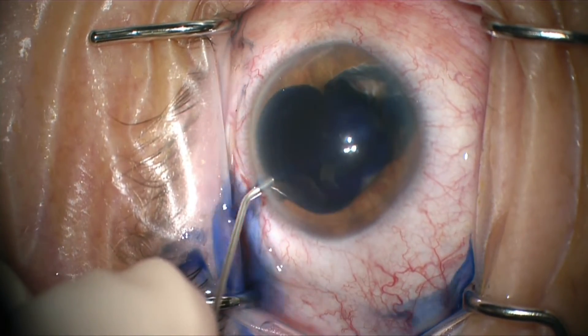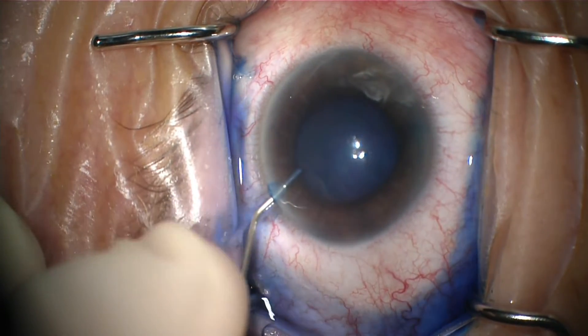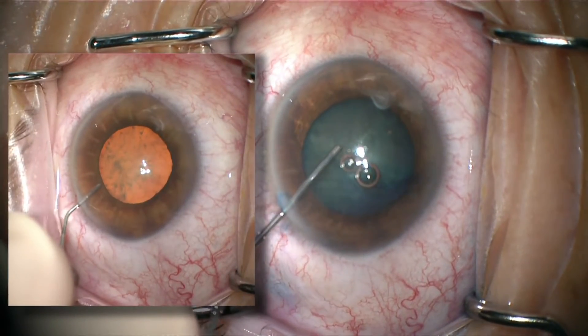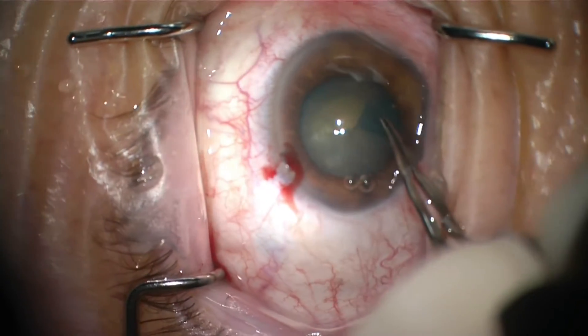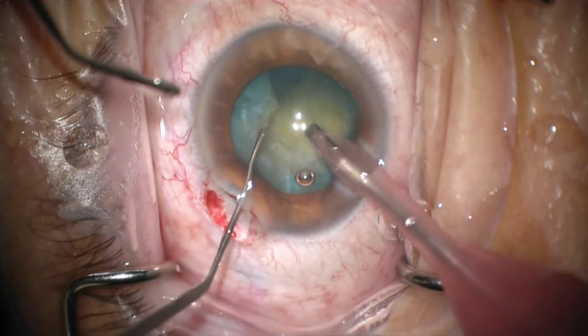We were able to handle it, but I think by trying to make our life easier, we ended up making it harder. You can see the red reflex wasn't terrible, but we thought this may become a challenging case, so let's just stain and make sure. And look what happens — after staining with Tri-Pan Blue, our red reflex is gone. That's because we ended up staining the vitreous. By trying to make this case easier, we really made it difficult for ourselves.